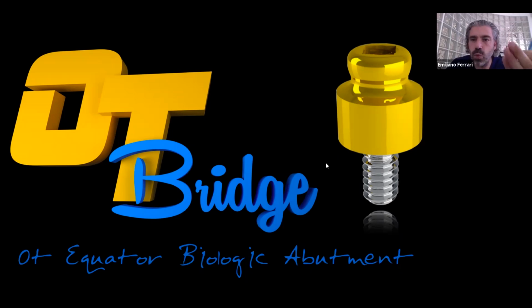Okay, what's the meaning of this OT bridge? You know that the mistake when you want to construct a fixed screwed rehabilitation on implants is usually the divergence between implants. If you use internal connection and the divergence is over 20-25 degrees, it's really difficult to have a perfect seal all around the implant platform.